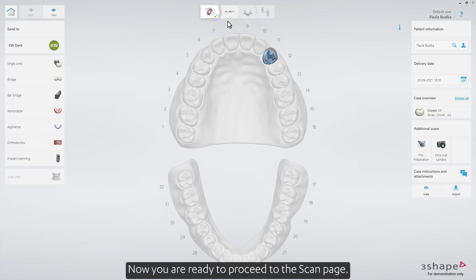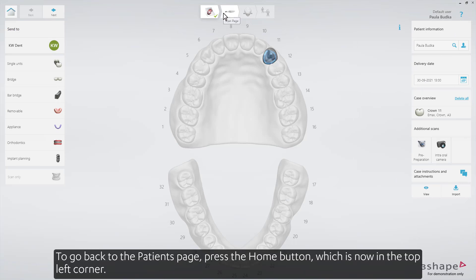Now you're ready to proceed to the Scan page. To go back to the Patients page, press the Home button, which is now in the top left corner.